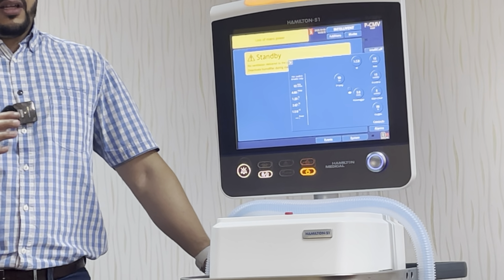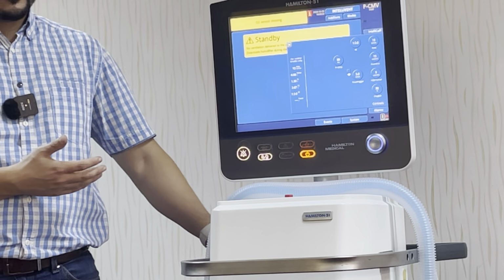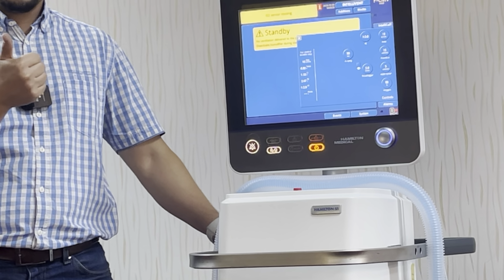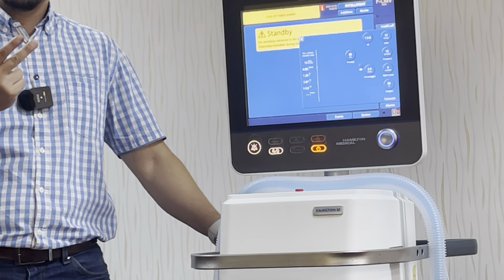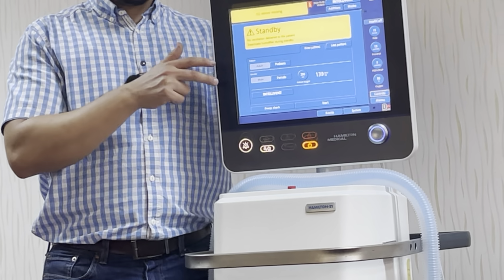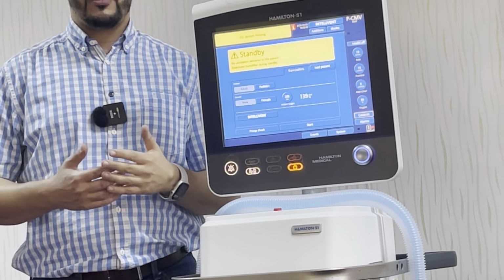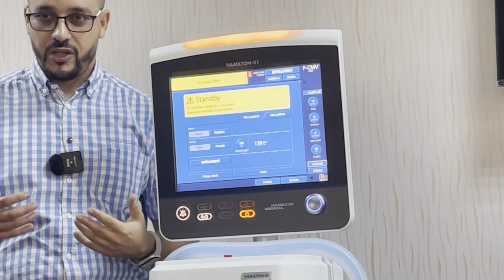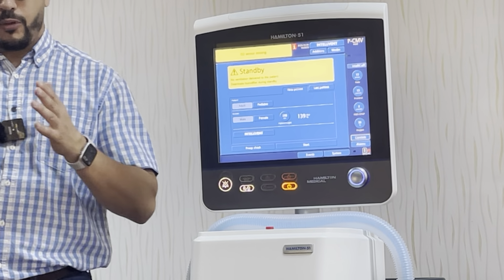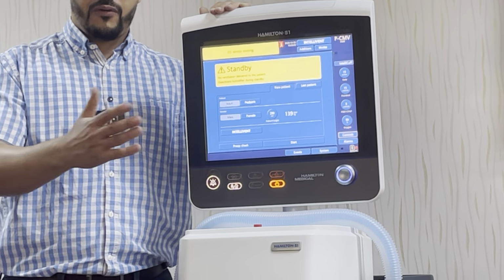So if the patient starts recovering and starts having some spontaneous breathing, what will happen? Fighting. Asynchronous. This mode is not designed for an active patient. So if the patient starts having some spontaneous breathing, the first problem is desynchronization, which causes the fighting. The patient will not be able to breathe freely because the machine will provide cycles of breath in a mandatory way. So in this case, we will have the fighting scenario.